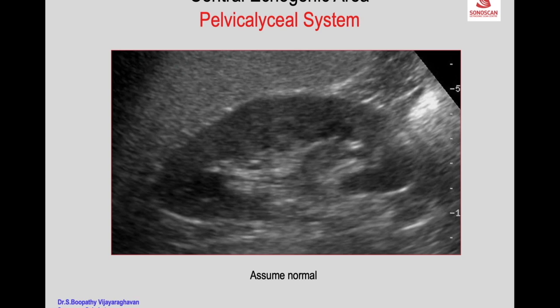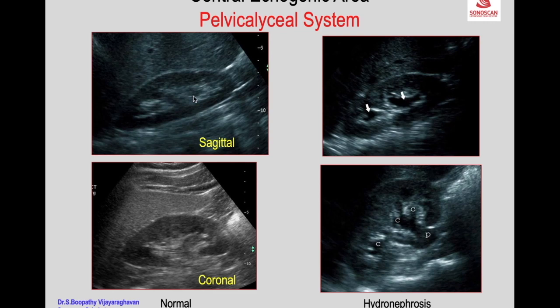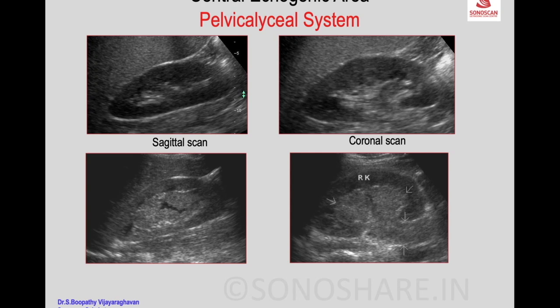Regarding the central echogenic area: the most important structure is the pelvicalyceal system, which normally remains collapsed and cannot be visualized. When dilated, the central echogenic area is splayed by the dilated collecting system, and on coronal scan you see the calyces communicating with the medial pelvis. The central echogenic area may also be enlarged due to sinus lipomatosis. Abnormally, if there is fluid between structures, it may indicate multiple polypoid masses; on coronal scan a mass extending into the ureter can represent a blood clot, sloughed papilla, fungus ball, or papillary TCC.